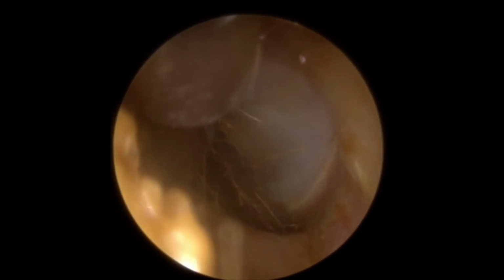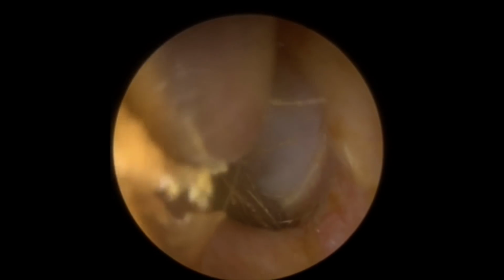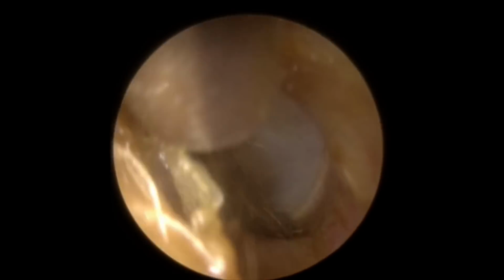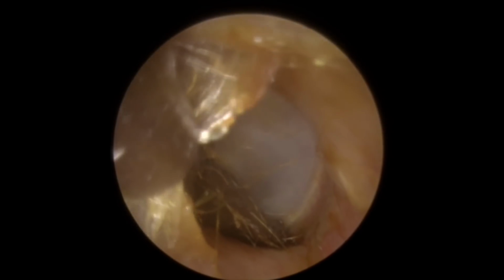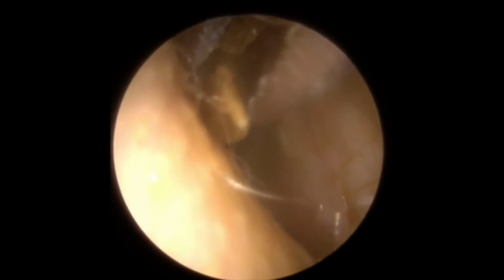So we're going to work this left side of the canal there. Pull it away from the canal there. Unfortunately, that skin sleeve is still continuing further in, so you'll see it's just the remnants of it here, a couple of little stray pieces of dry skin. Pulling down from top and left canal wall. Not going to come away with suction very easily, so I'm just going to use the crocodile forceps here just to try and take the worst of it away.